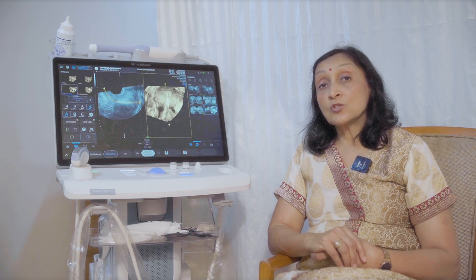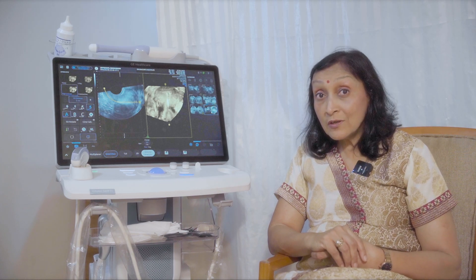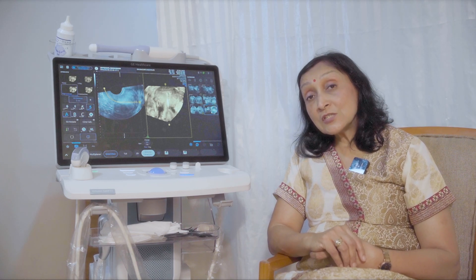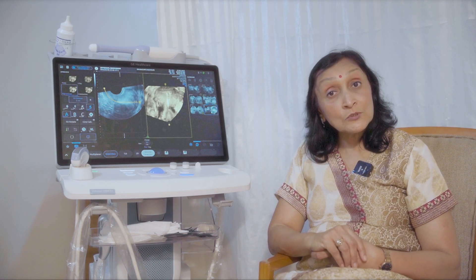The Dopplers are as brilliant as any other Voluson machine. What's more, all the essential infertility softwares like SonoAVC and VOCAL are all available on this machine.